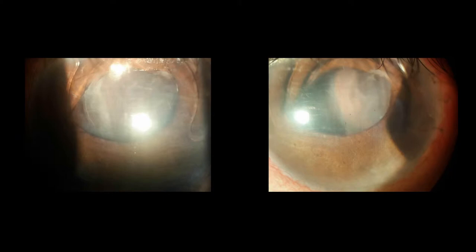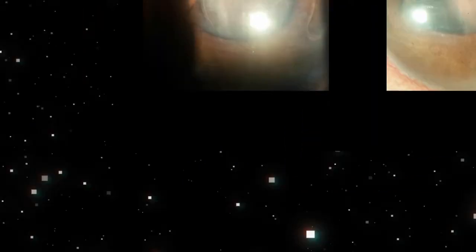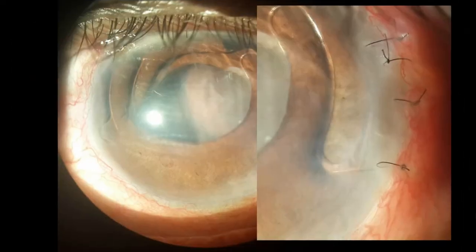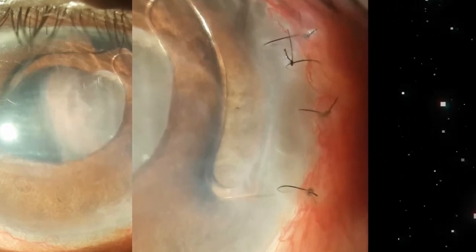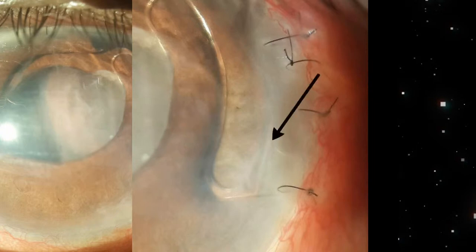This eye had hypotony after cataract surgery and kissing choroidals. In this magnified view of the site of incision, one can make out that the haptic is in between the two lips of the incision, thus leading to a wound leak and hypotony.